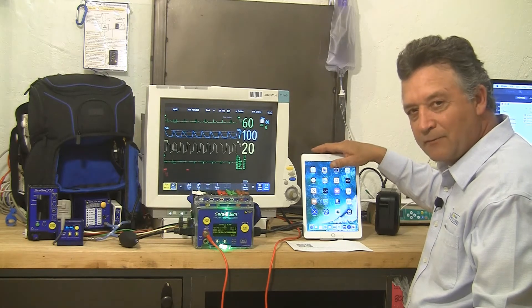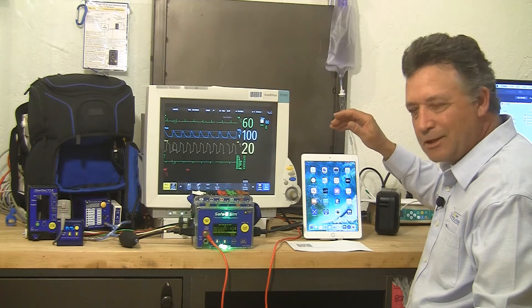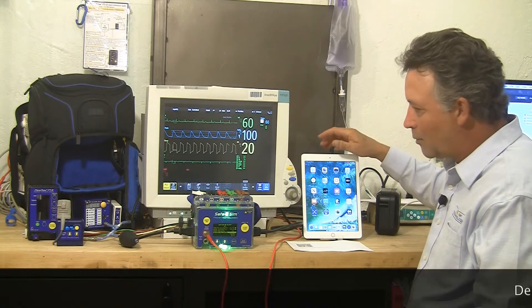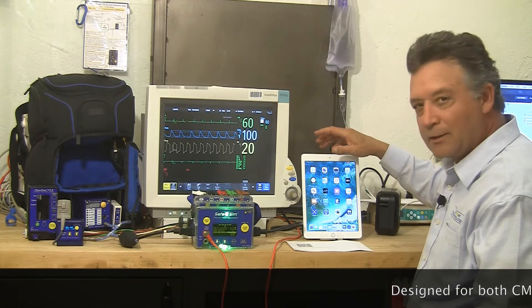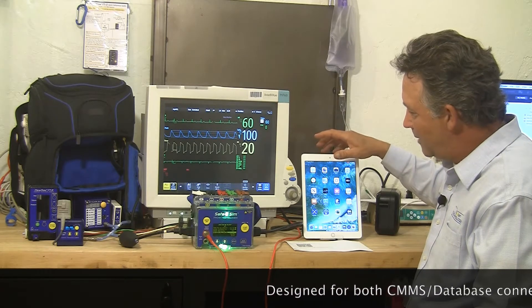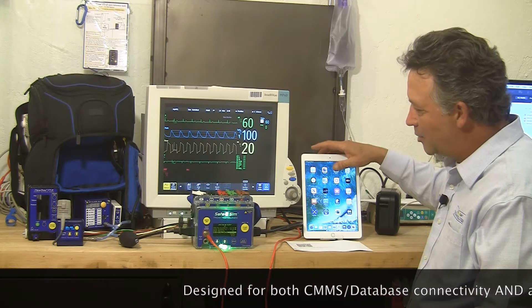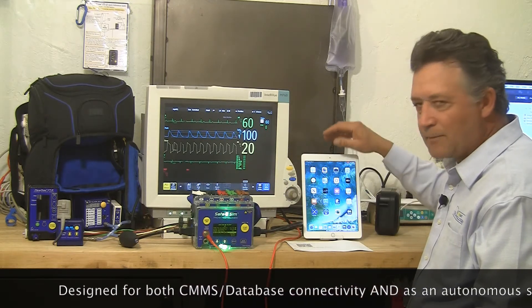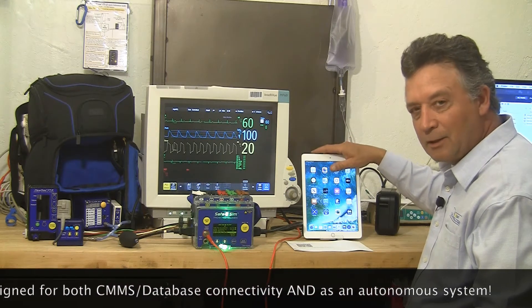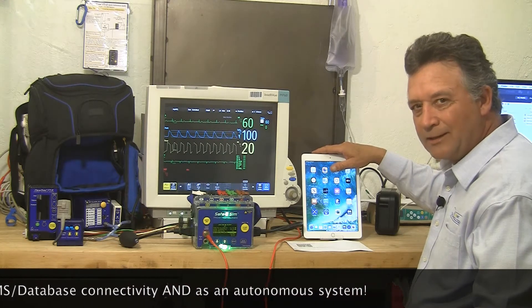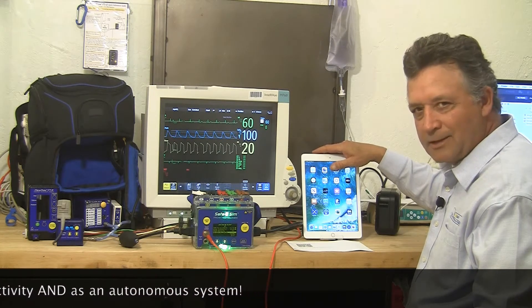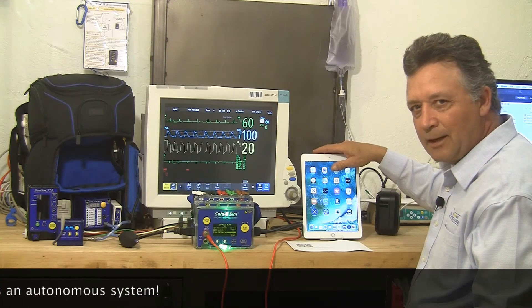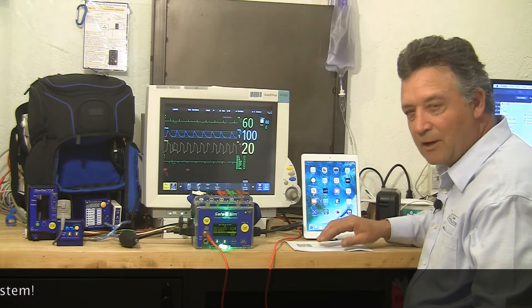For the sake of this video, I'm going to use an iPad because it's easier to see than an iPhone, but we're going to walk through a demonstration of how, with Pronk Technologies Mobilize solution, you can wirelessly control your test devices from Pronk as well as capture measurements back into an electronic record very easily, very quickly, without having to write test results down, and all of that can be synchronized with a CMMS system if you have one.